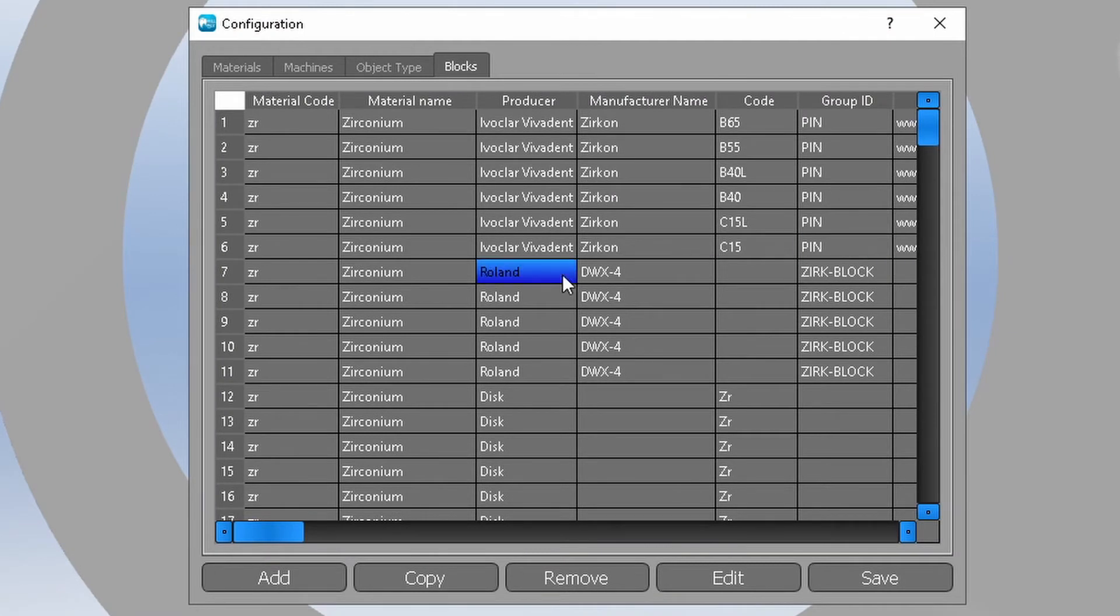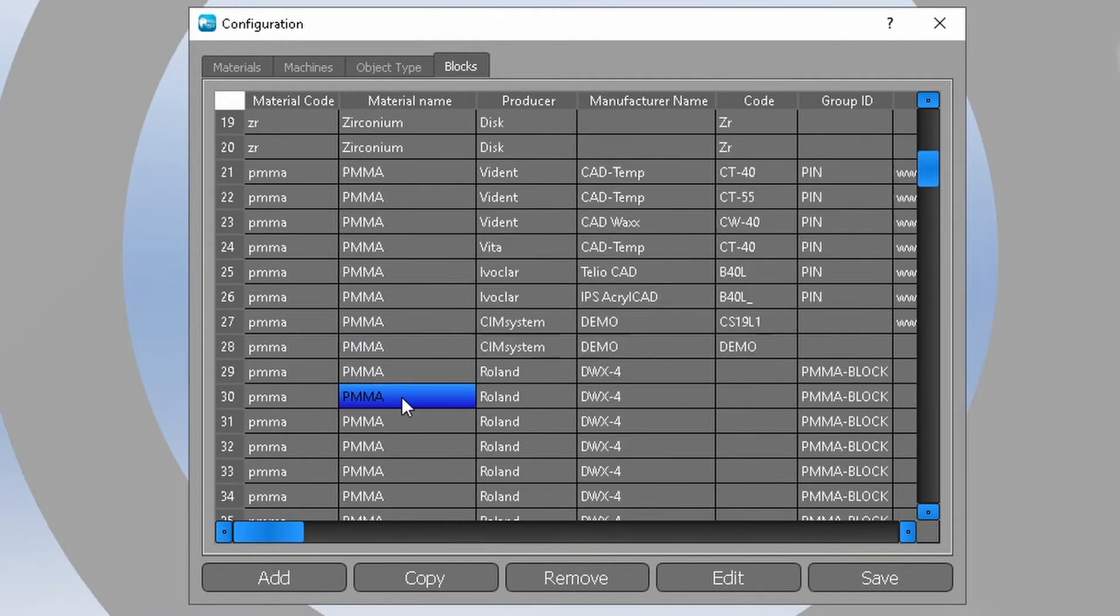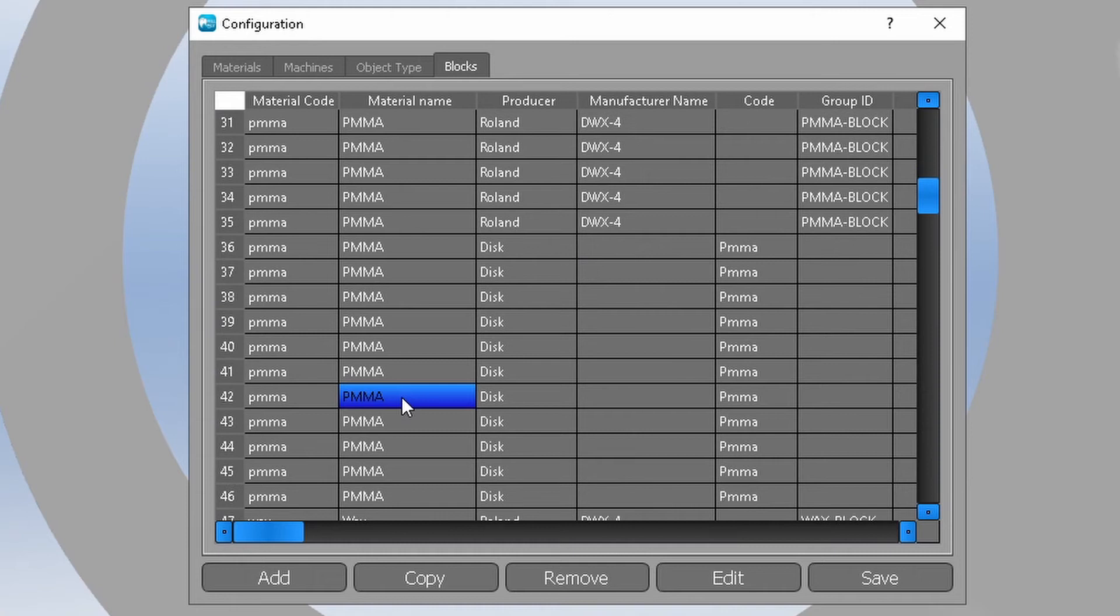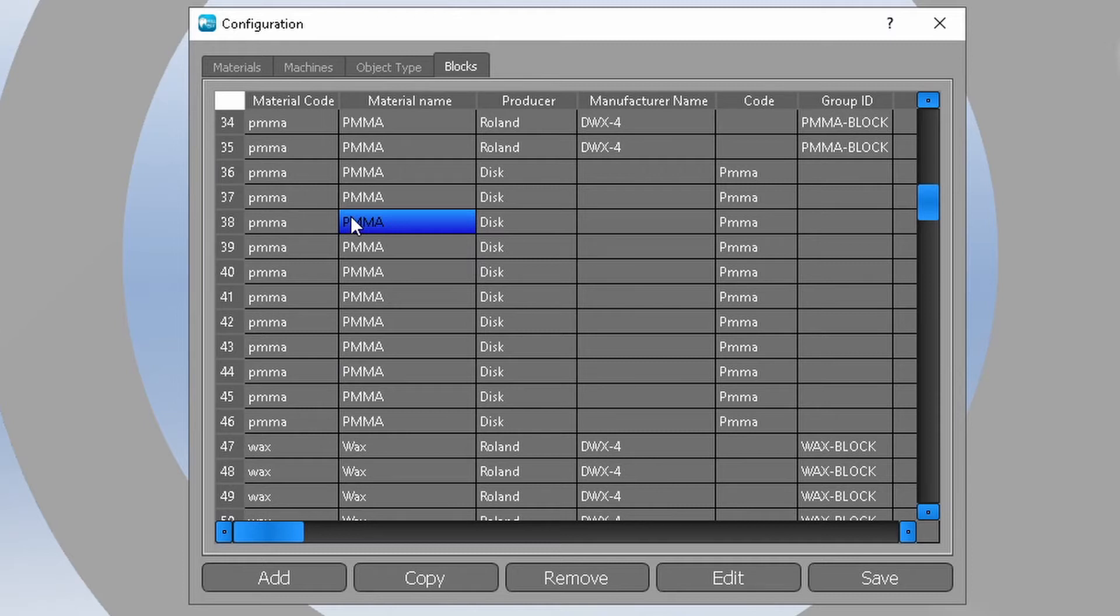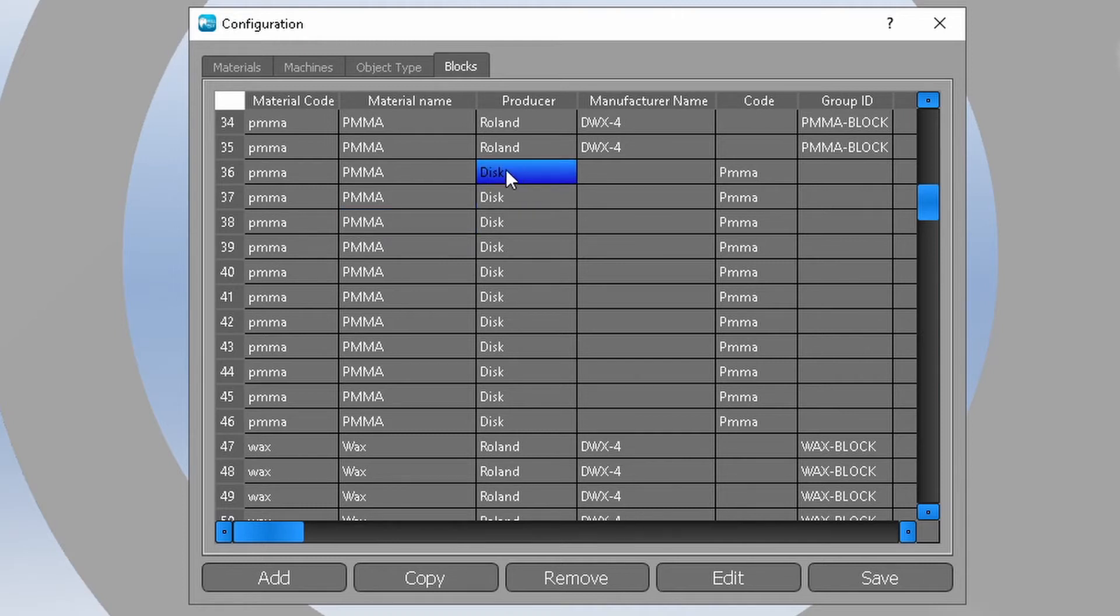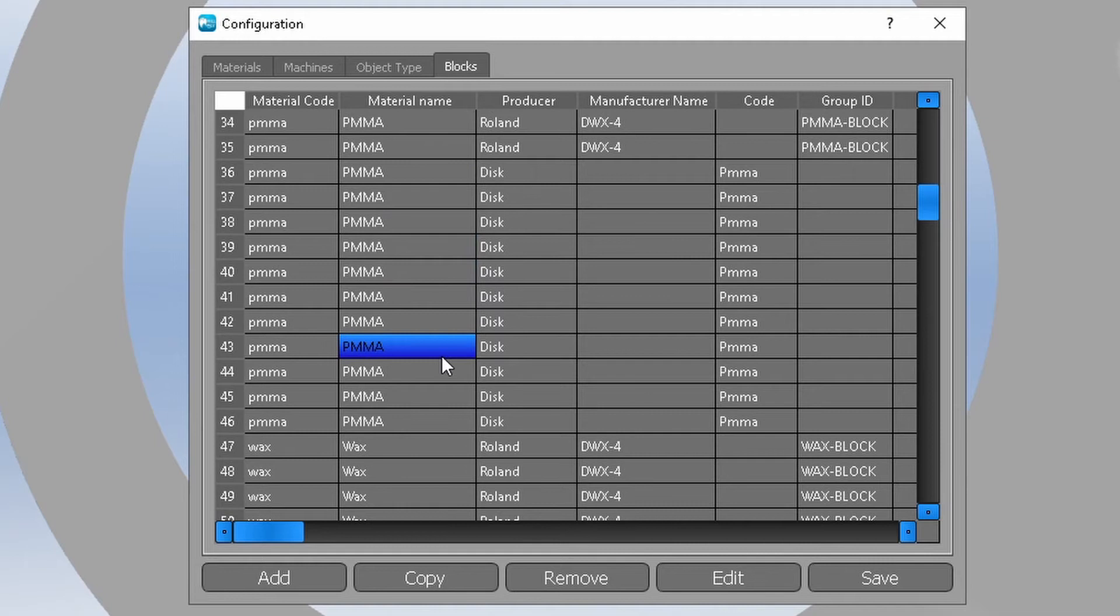In the material name column find the group of lines with the material for which you want to add a new blank size. In this case it is PMMA. Please notice that some lines may have specific producer and manufacturer name specified. For the most cases you are looking for lines with disk specified in the producer column.